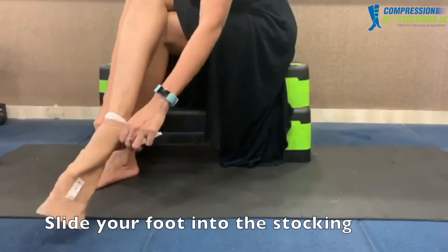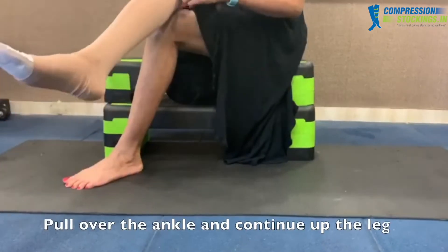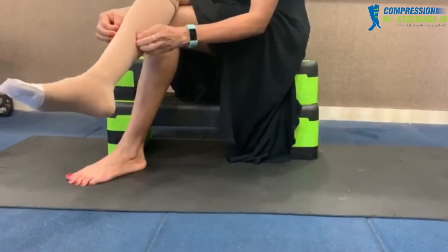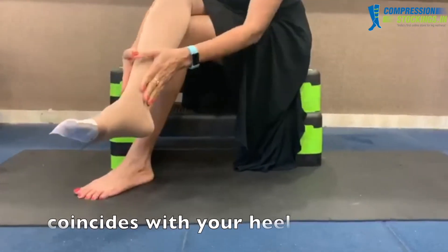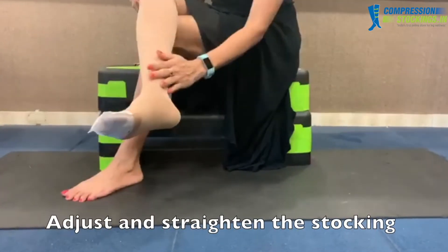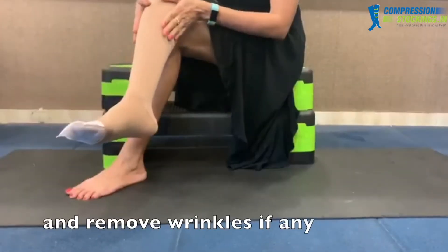Slide your foot into the stocking. Grasping the top of the stocking, pull over the ankle and continue up the leg. Make sure that the heel of the stocking coincides with your heel.